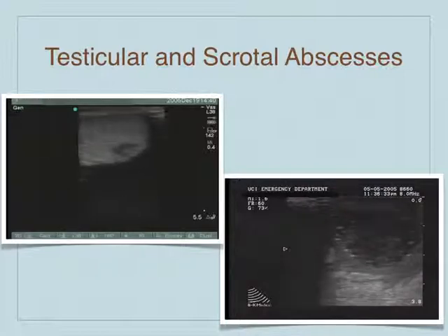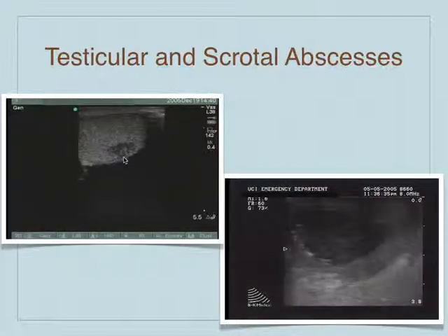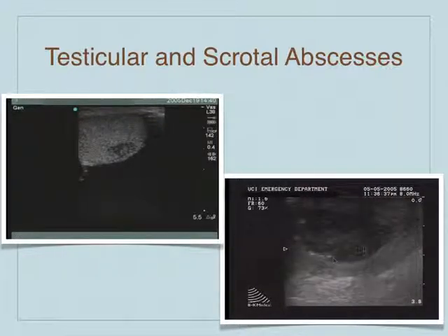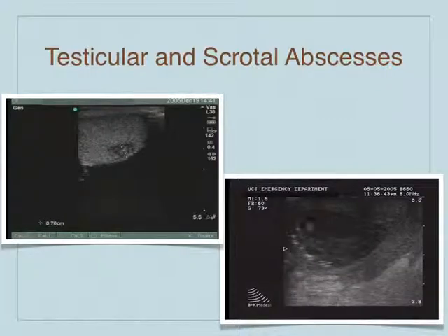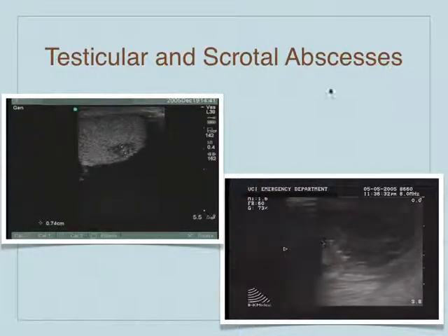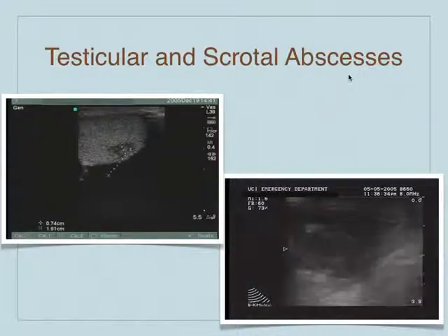And you can see abscesses within the testicle itself or adjacent to the testicle in the scrotum. So that's another way we can use ultrasound to differentiate an infection, the location of the infection, and all abscesses must be drained surgically.